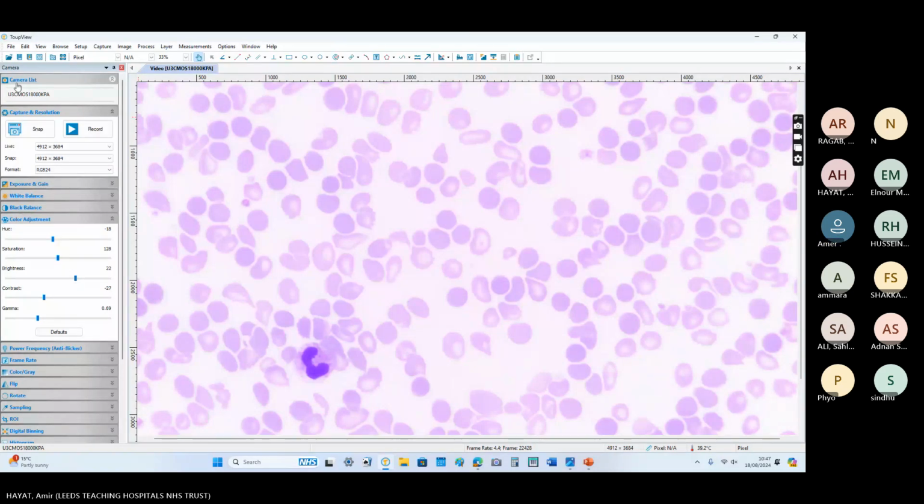And then if there is hemoglobinopathy, would you like to confirm that on a second test as well? Yes, because with hemoglobin electrophoresis, you can make a diagnosis of hemoglobinopathy if a few tests using different methodology are positive for the mutant.